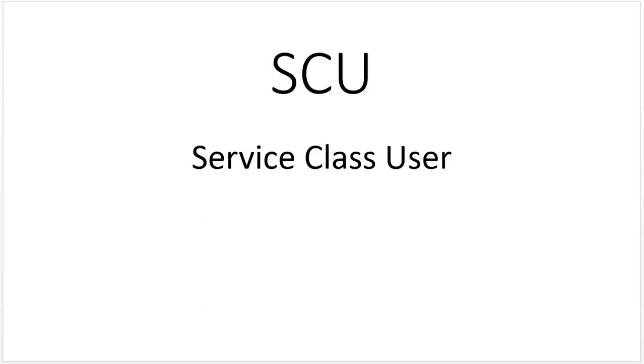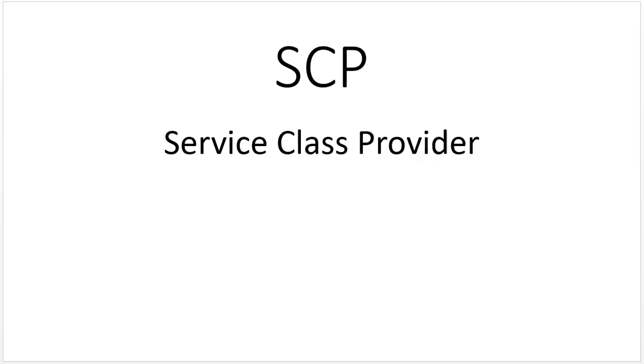SCU, Service Class User. In this case, it's an application entity that is requesting a service. I'm the CT scanner. I would like to store these images on PACS. When it asks PACS to store its images, it is the SCU. SCP, Service Class Provider. This is the other side of that equation, the application entity that's providing the service to the SCU. So you have a user requesting a service, and then you have an SCP, service class provider, that provides the service that's requested by the user.